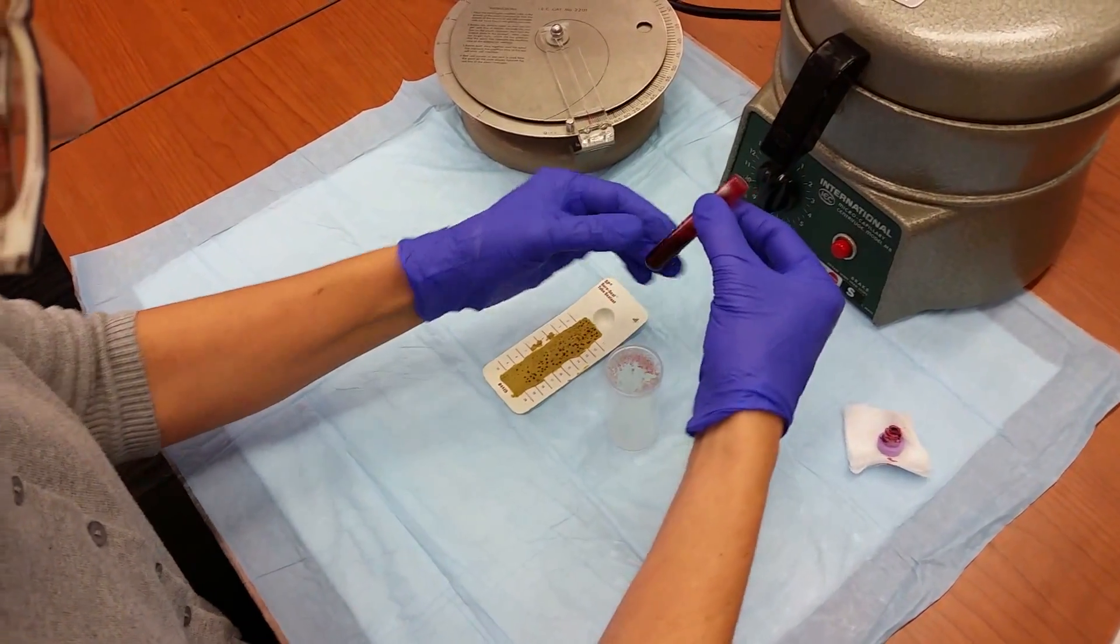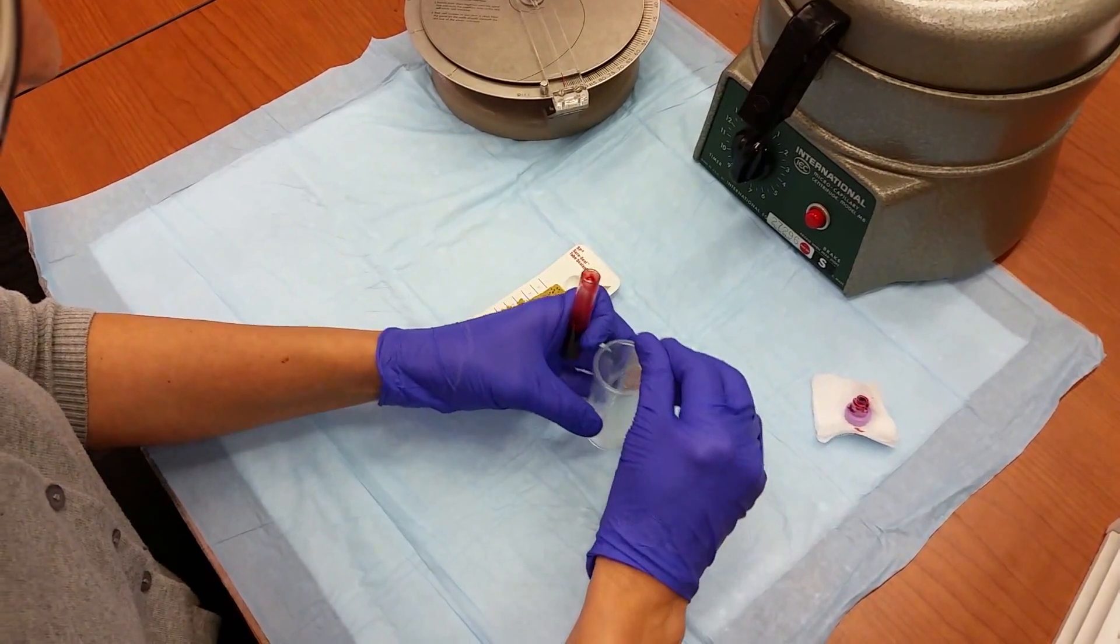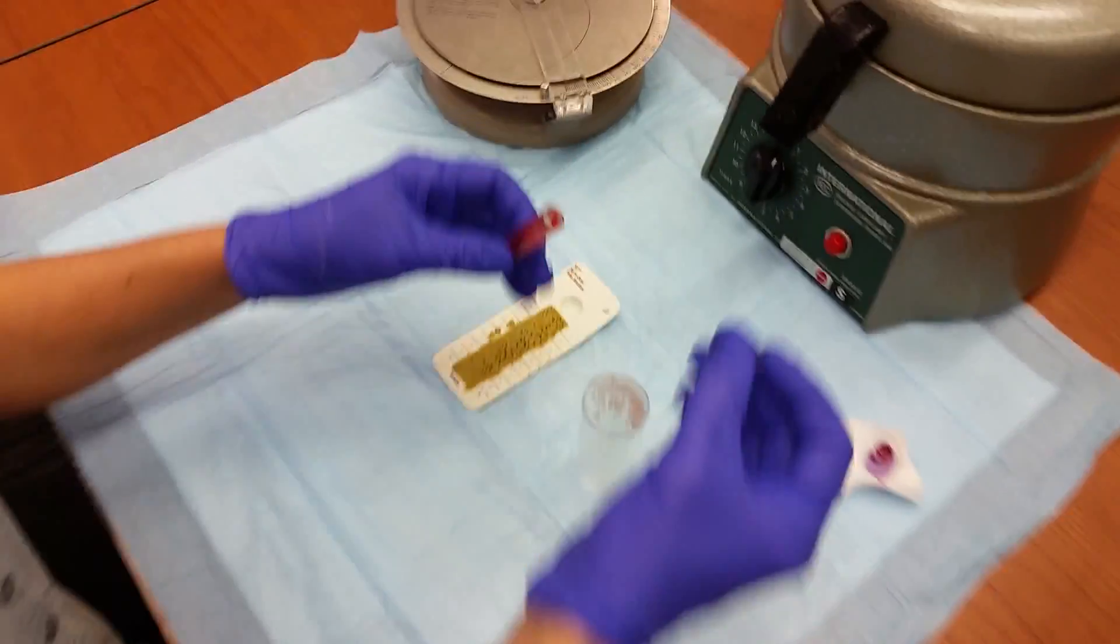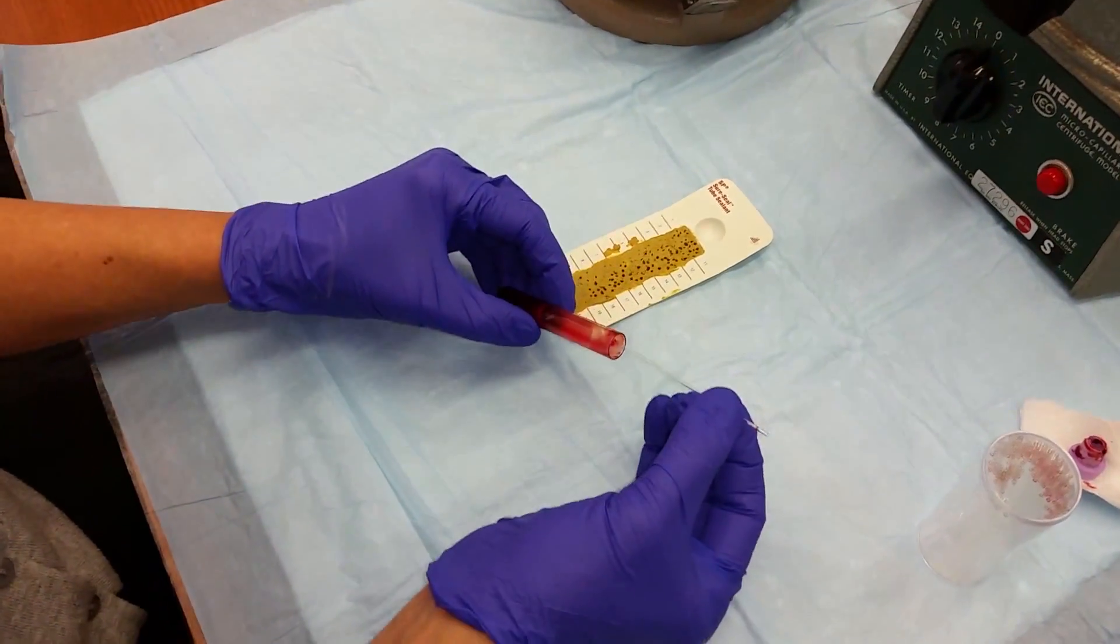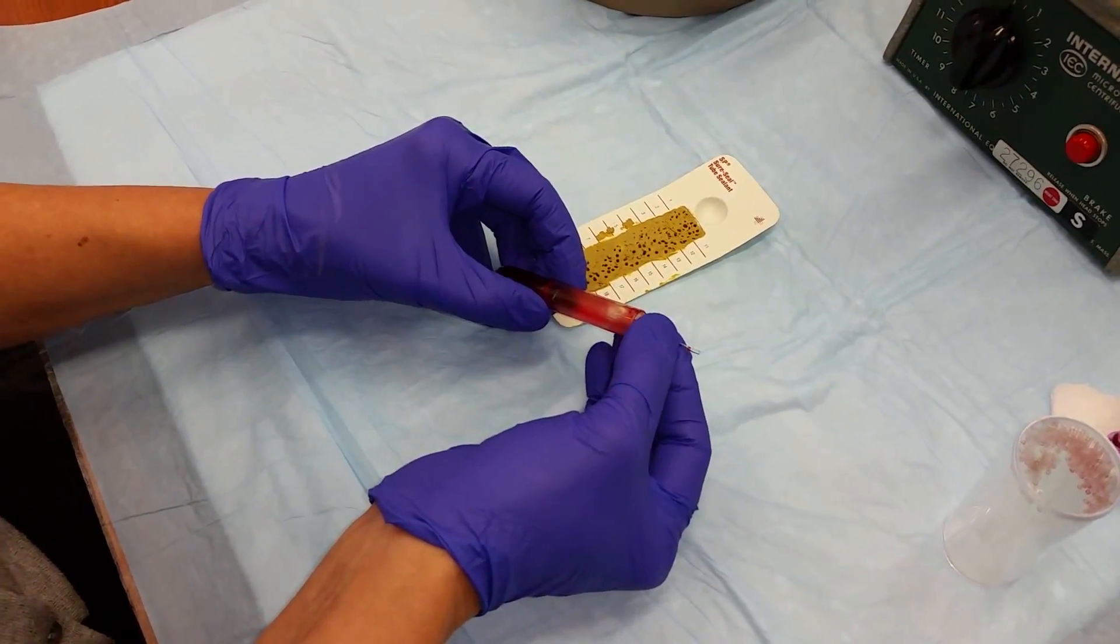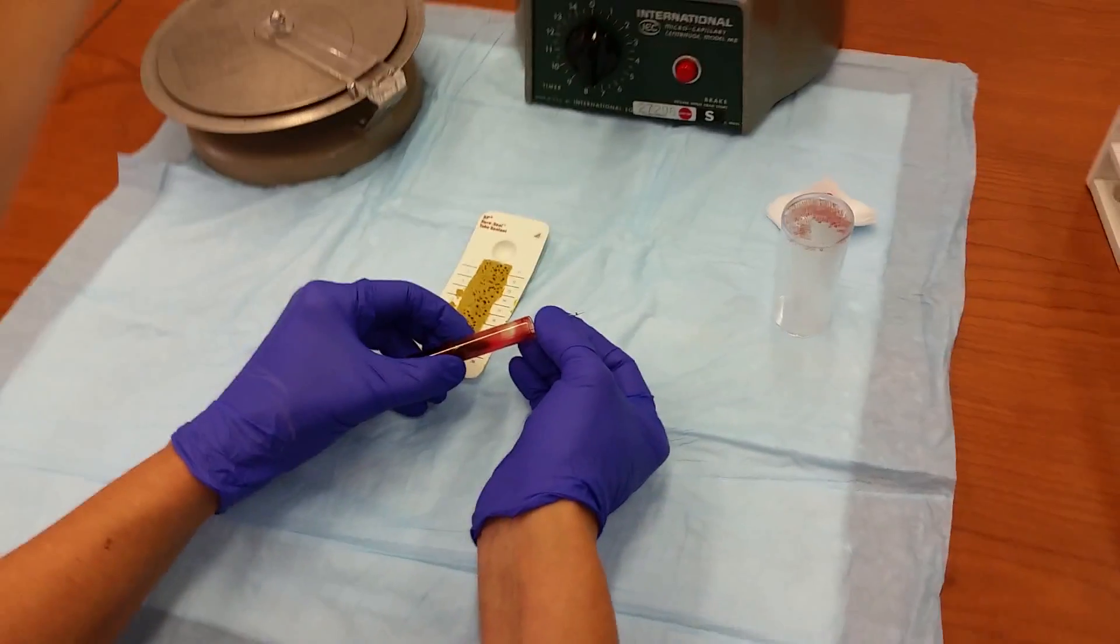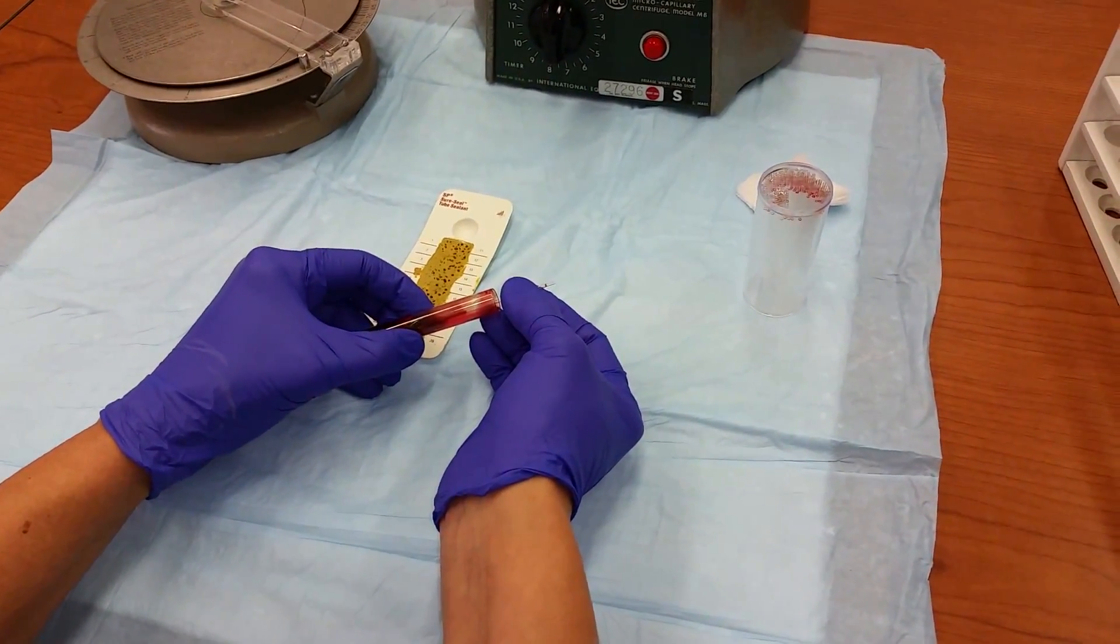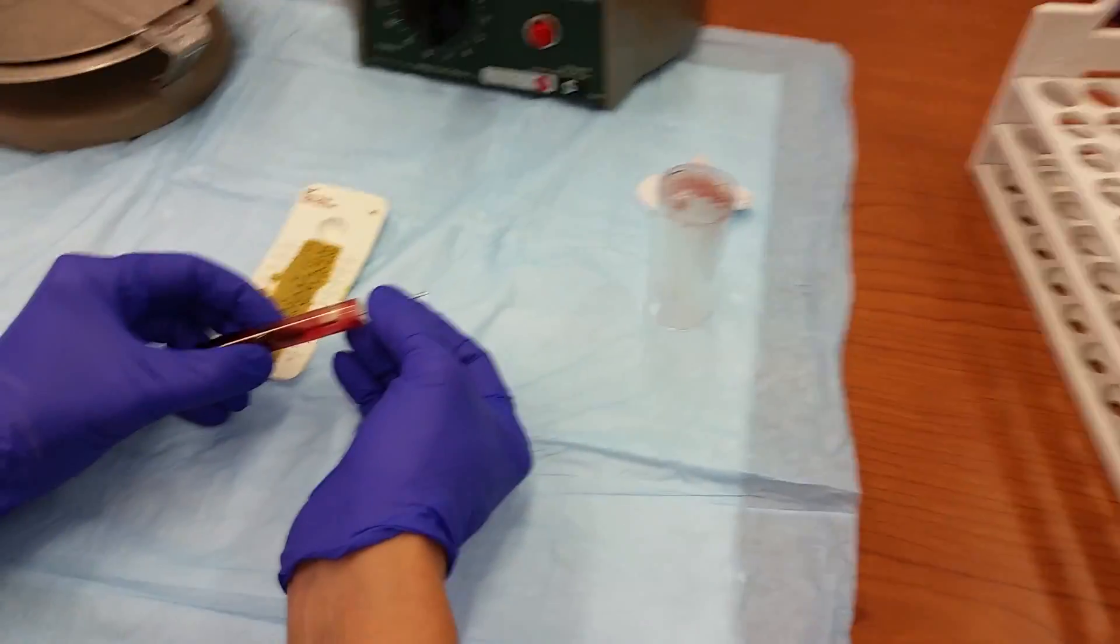You're going to take your tube of anticoagulated blood. Take one of the microcapillary tubes and place it inside the tube, holding the tube at an angle so that the blood will travel up the capillary tube by capillary action. It takes a few minutes. It's not necessary to have the blood go all the way up to the top of the tube, but you want it to at least pass the halfway point.